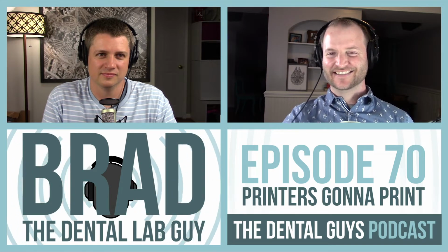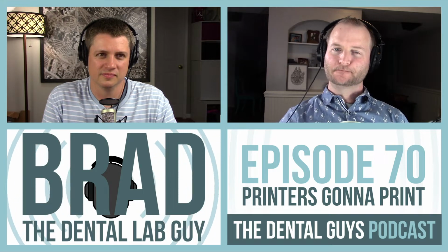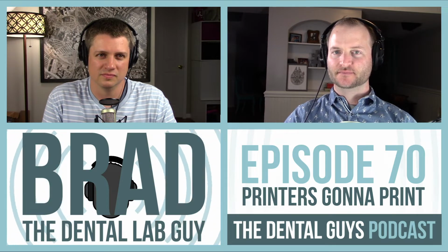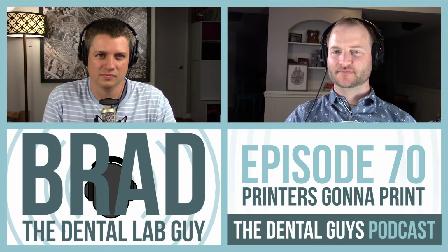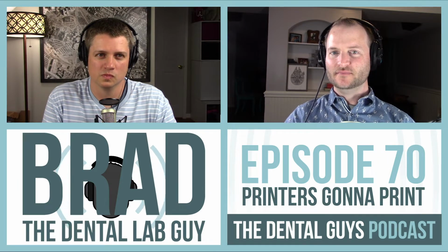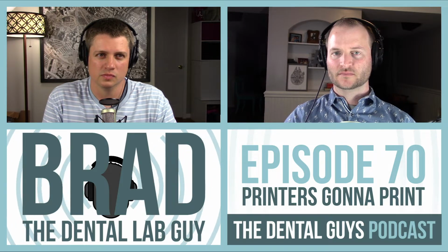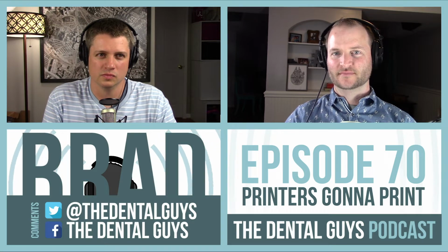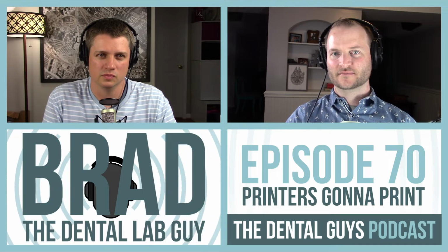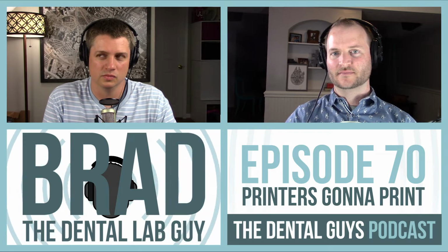So we started research, and how we did it is we took an STL file and a dental model. We sent it to every manufacturer of 3D printers at that time. So 3D Systems, Envision Tech, Stratasys, those were probably the three earliest printing manufacturers on the market. We sent those models out, and we got them back in, and we're like, well, okay, they look awesome. I mean, they look really cool. They're 3D, they're really neat looking, but how do you know they're accurate? How do you know that anything's going to fit on them? So then we used some software where we used a scanner, and we scanned the model in after it's printed, and you superimpose the STL file onto what the end result is.